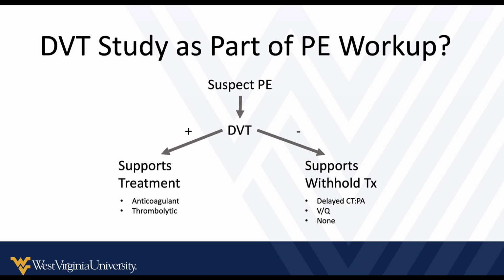Or in a patient, maybe you suspect PE and they are quite sick. Maybe they're in shock or they have signs of clear respiratory distress. If we suspect massive or even maybe a submassive pulmonary embolism with the whole clinical picture, and we probably would include ultrasound of their heart, then finding a DVT in an extremity helps to support the decision to administer systemic thrombolytic therapy, especially in a patient who maybe is too critically ill to go for CT scan, or maybe has a true significant severe contraindication to an immediate CT scan.